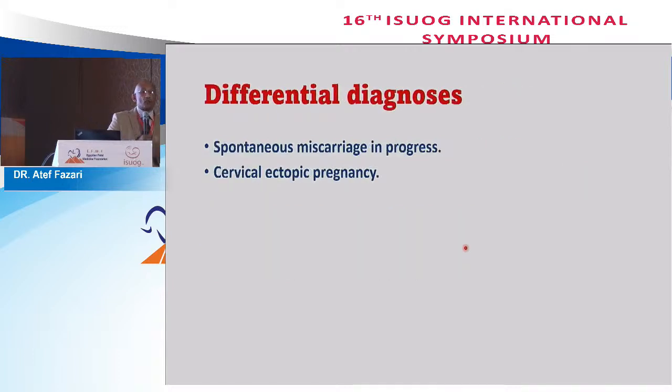Coming to the differential diagnosis of scar pregnancy: either spontaneous miscarriage or ongoing miscarriage, and the rest. But when you apply Doppler to a dead miscarriage like that, there is no flow, and it is most probably in the midline, associated with some features of miscarriage like pain and bleeding and so on. Especially if the patient was followed regularly, maybe with a previously documented pregnancy site.